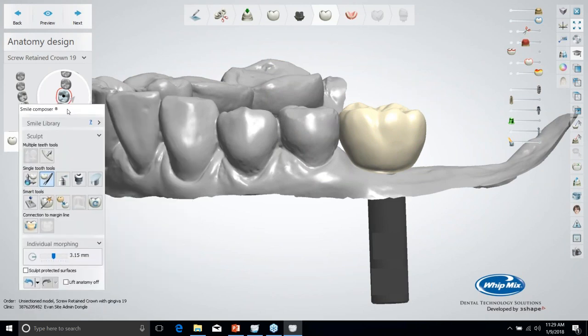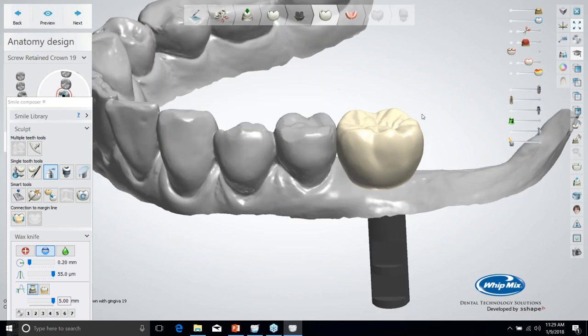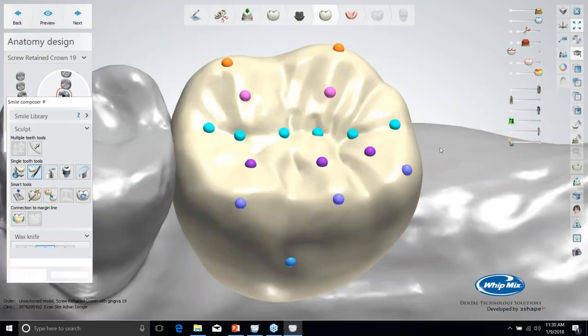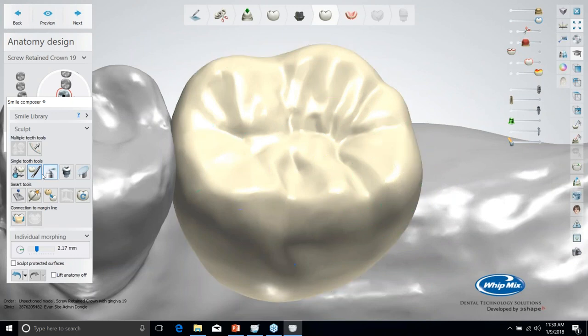Now we're in our second anatomy design stage. This is where we're going to finalize this screw retained crown. Again, you have the same options as you had before in any full contour design in 3Shape. I'm not going to spend a lot of time talking about the different tools, just because if you've used 3Shape, you'll be familiar with them.